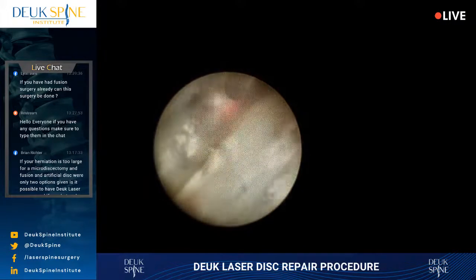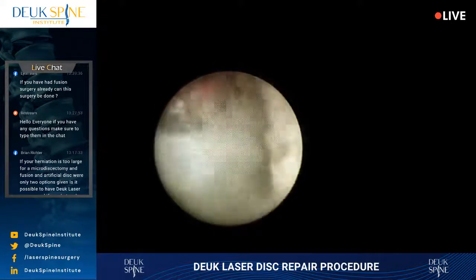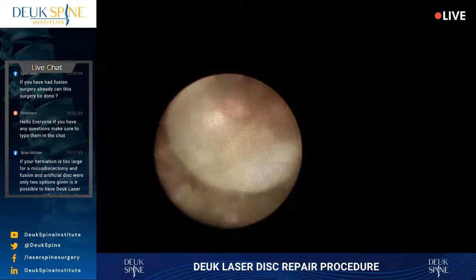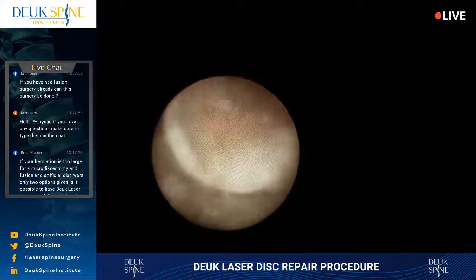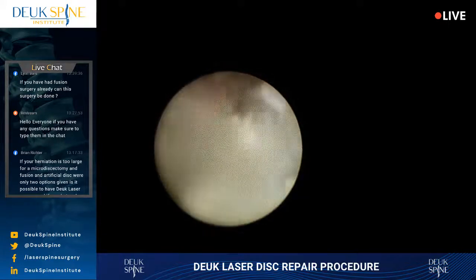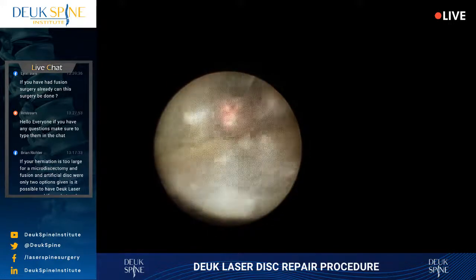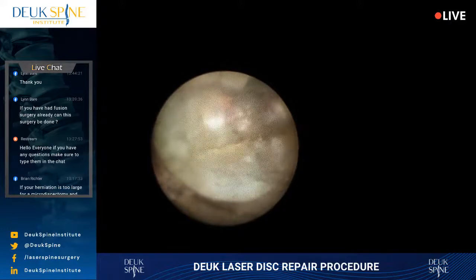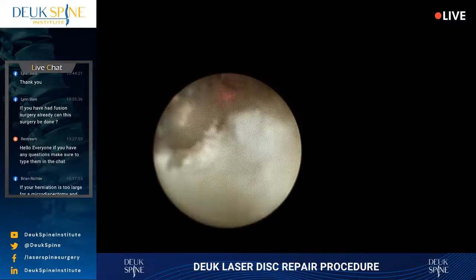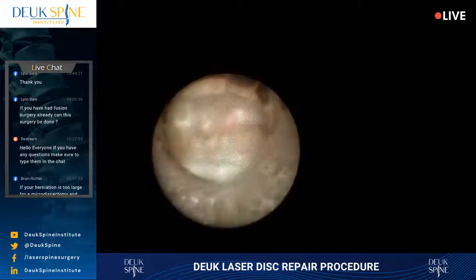Of all the things I do with lasers and scopes, this is the hardest. Right here, right now. Because you're operating on top of the spinal cord, and you really want to make sure you get everything you can. It looks like there's just a lot of scar tissue there. Okay, right in the middle. And it almost looks calcified, if you ask me. Some calcium down there.